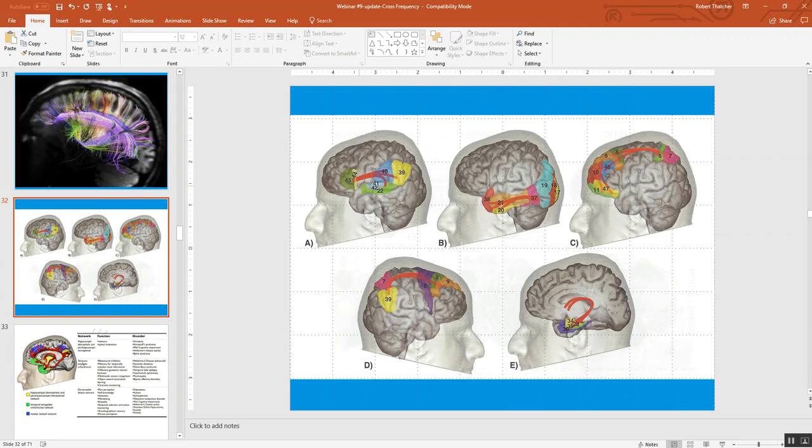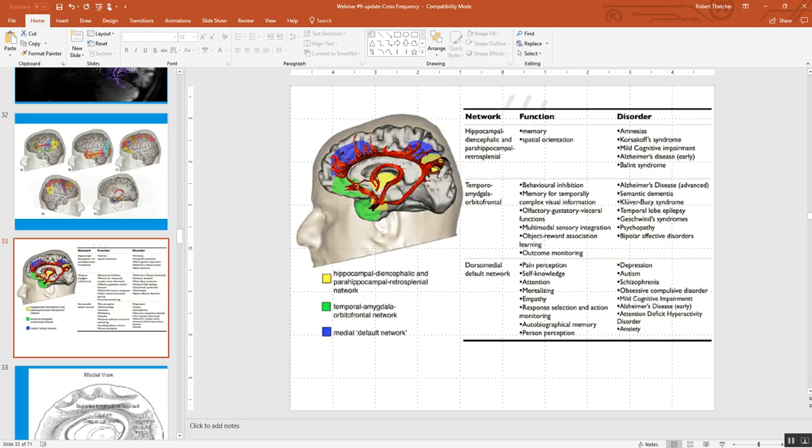So one can look at, using cross-frequency measures and effective connectivity, the magnitude and direction of information flow between these hubs. They can only be achieved by creating a marriage between structural imaging, in this case diffusion tensor imaging, and the EEG, which is more functional and effective connectivity.